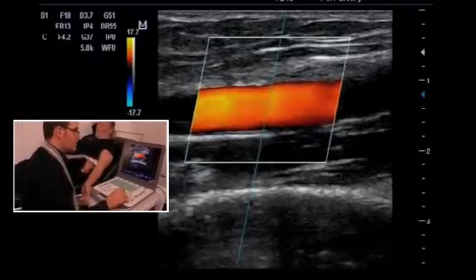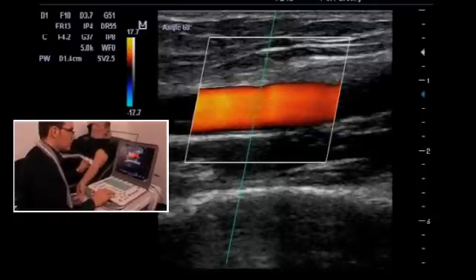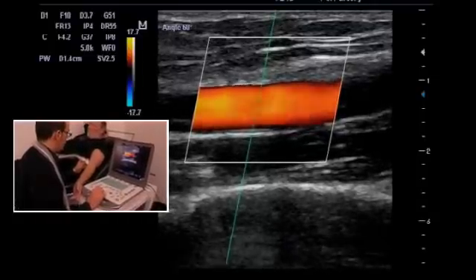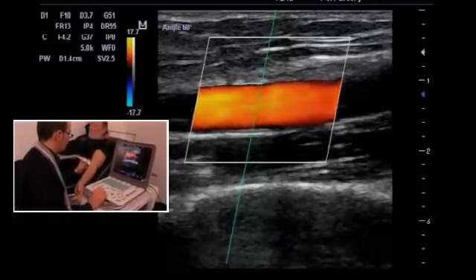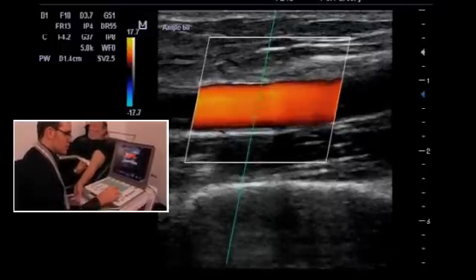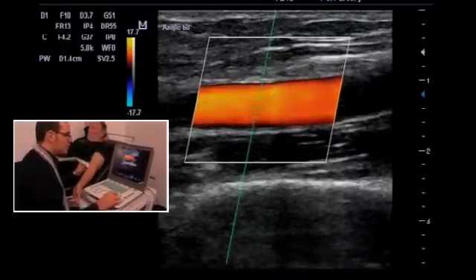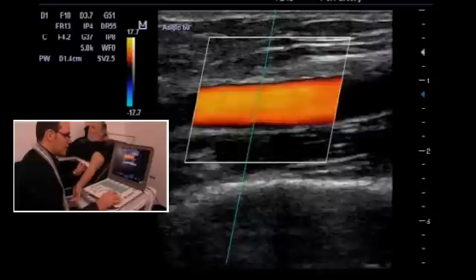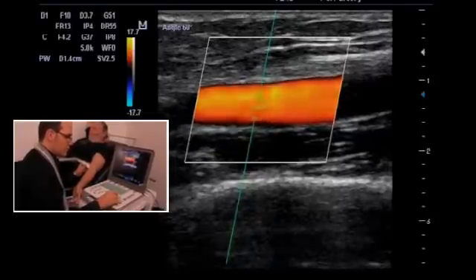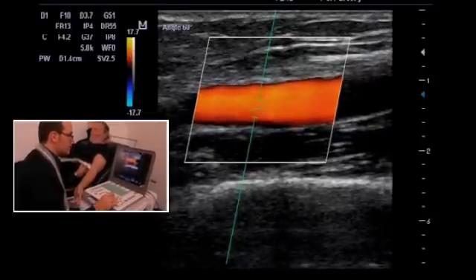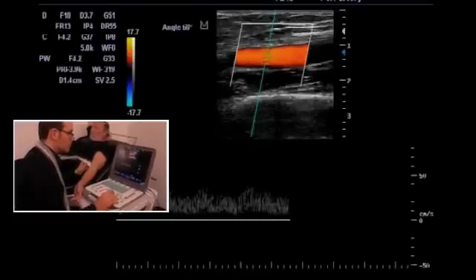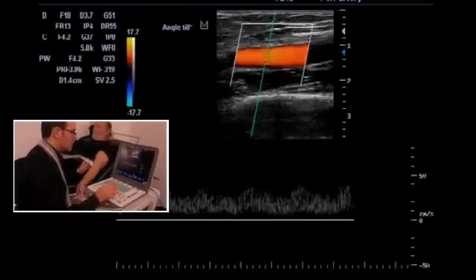If we look with the pulsed-wave Doppler in the brachial artery prior to the anastomosis, we will see a flow pattern characterized by a low resistance pattern, with a high diastolic flow.